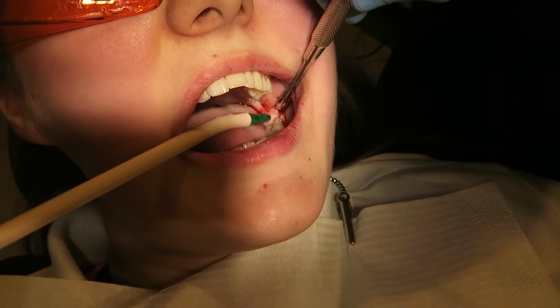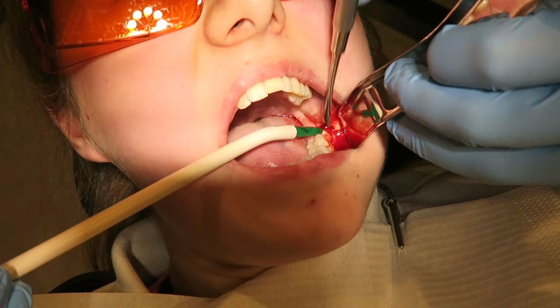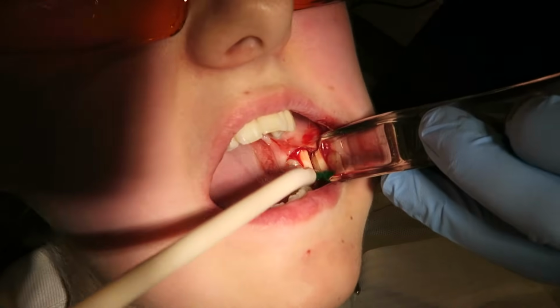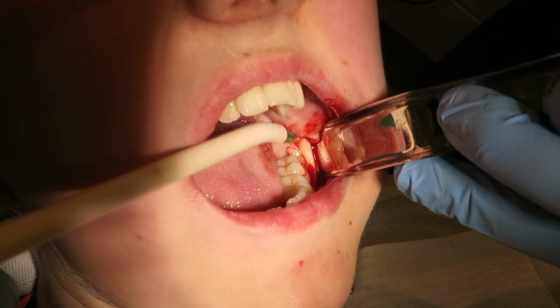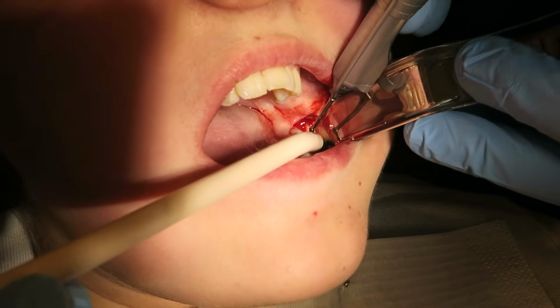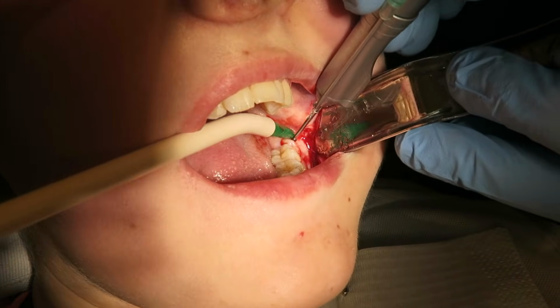If you cut a nice flap, if you cut a nice incision down to bone, then the flap should raise nice and easy with no effort at all. Now you can see it's a full thickness mucoperiosteal flap. Now I'm going to make a buccal gutter.